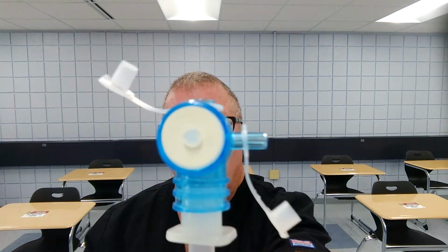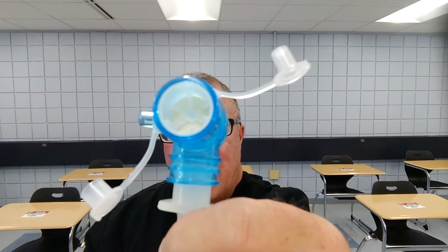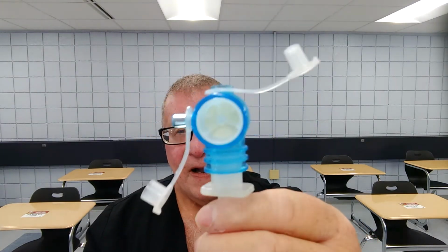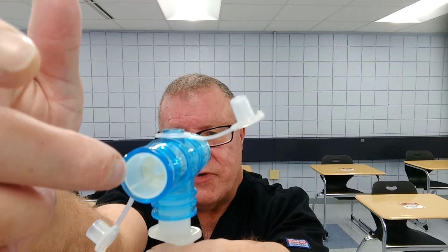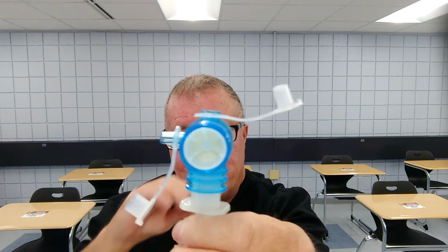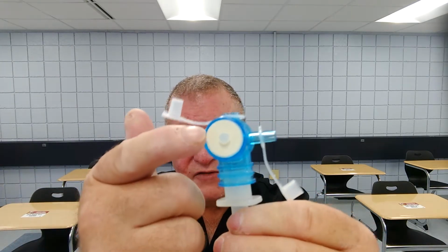It comes like this. If you look, there's a one-way valve on this side, and there's a one-way valve on that side. So what you have to do is look at your one-way valves. You want them to breathe in through here, and that valve will open. When they exhale, the air will hit it. It's not going to allow it out. It's going to send it out the other side, which goes to your respirometer so you can monitor them.